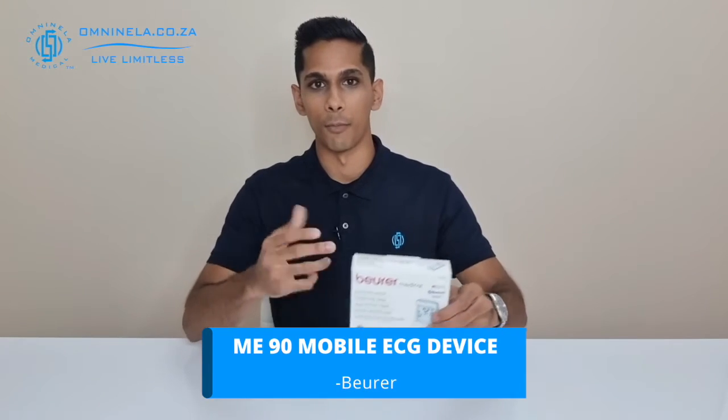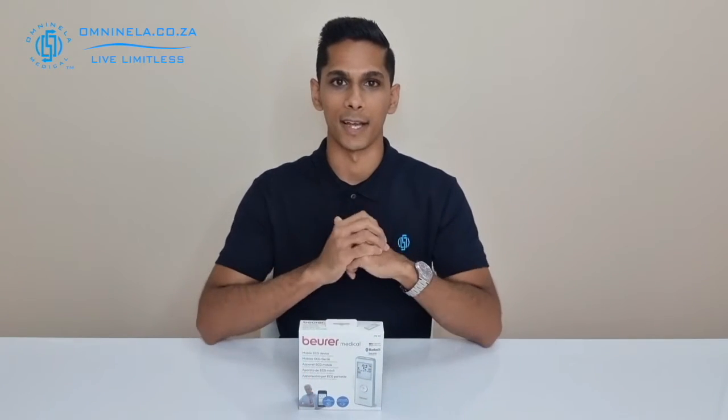If you have or are recovering from any disruptions in your heartbeat, also known as arrhythmia, and your doctor has recommended you get a device to help monitor these disruptions, then the ME90, which is their mobile ECG device, may be an item you'd like to consider. In today's video we're going to do a quick unboxing of the ME90, find out what features this device comes with, and also what items are included inside the packaging.